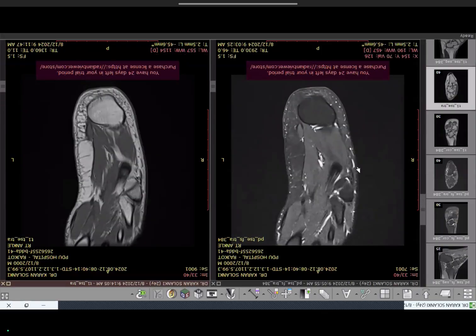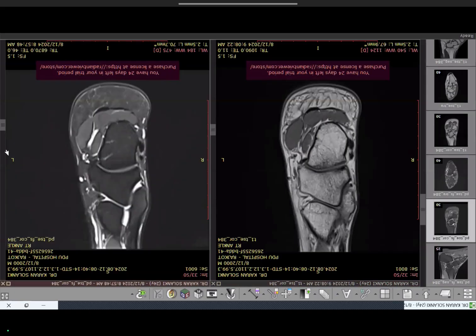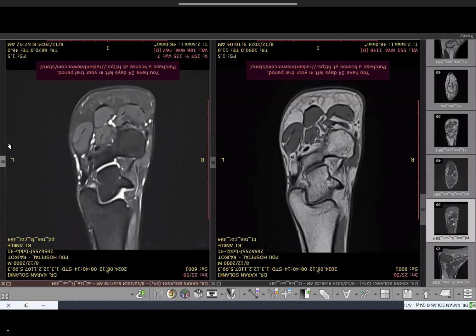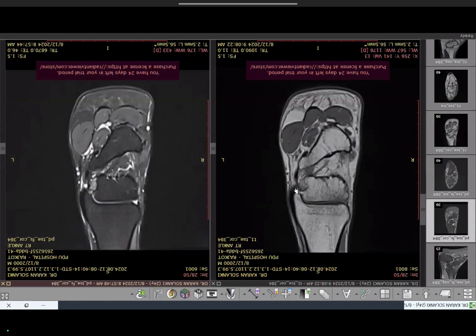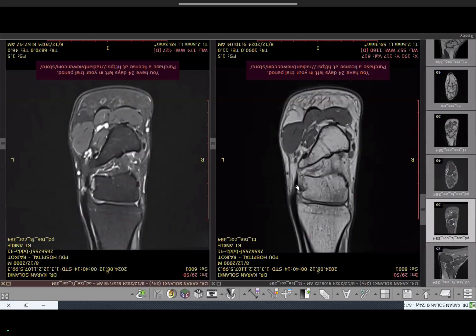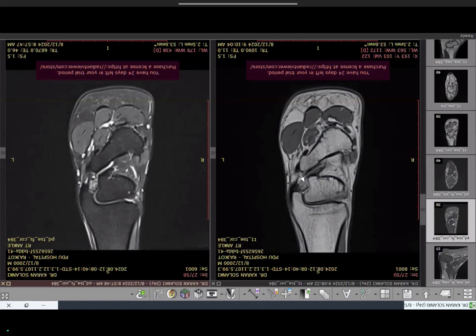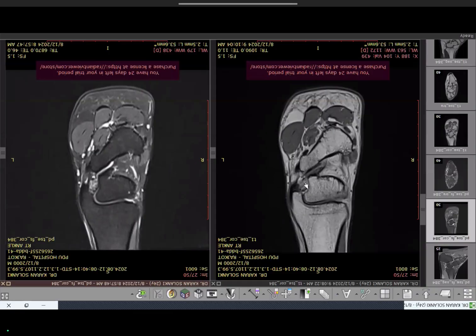Now coming to the coronal sections. The most important structure not well seen in axial or sagittal is the deltoid ligament. It lies between the medial malleolus and the talus — a rectangular structure in the deepest part. It appears somewhat heterogeneous even on T1, appearing nearly isointense to marrow, because of synovial fat within the deep fibers. On PDFs it appears hyperintense due to magic angle effect. Please do not report this as a tear — it is the normal appearance of the deep deltoid.